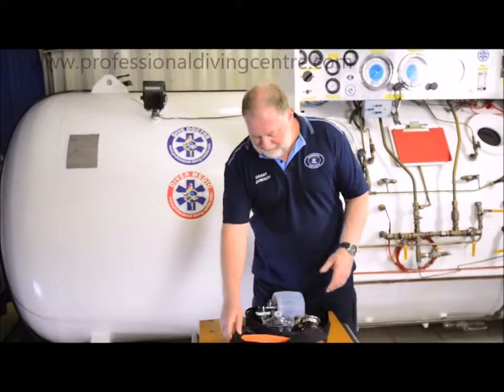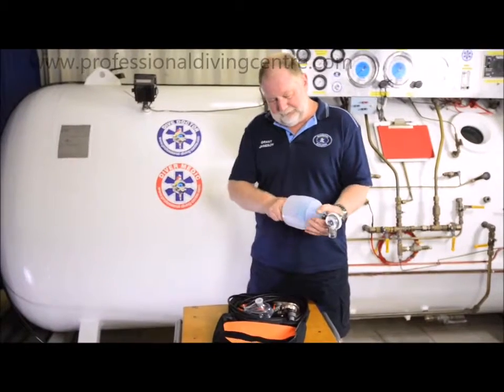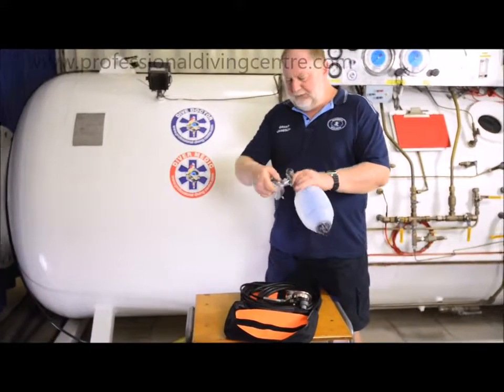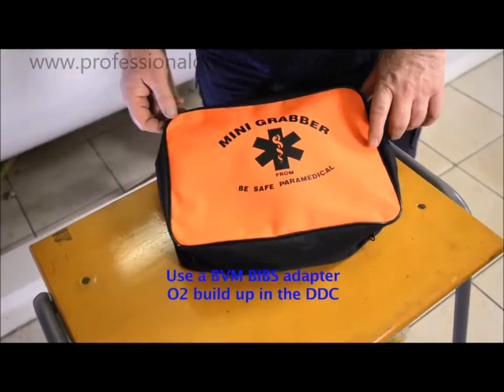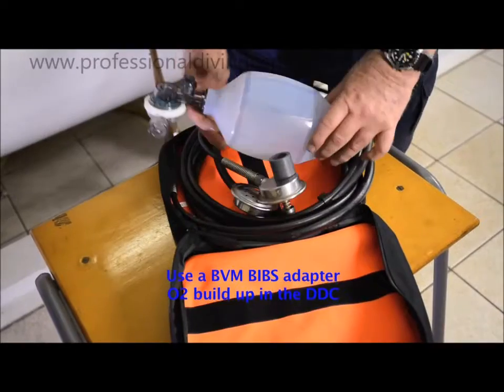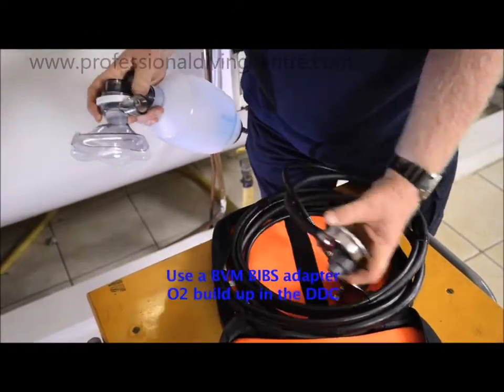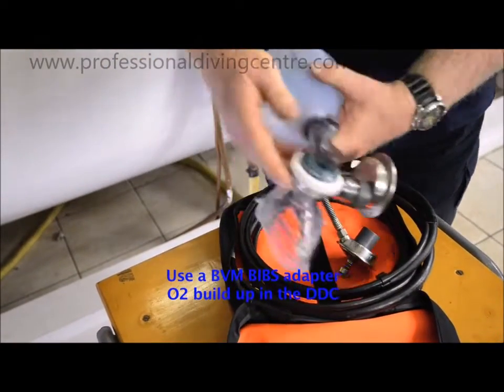What we have here is an ambu bag which has adapters to the chamber BIBs, so that when we supply the patient with oxygen in the chamber, we don't allow the oxygen to be exhausted into the chamber. We connect it up — these are the adapters. You put it on the side that you exhaust, you put your inlet on the bottom so it can fill the bag.